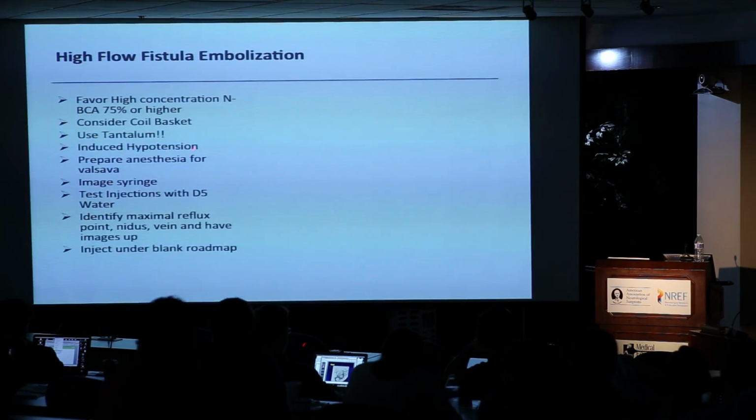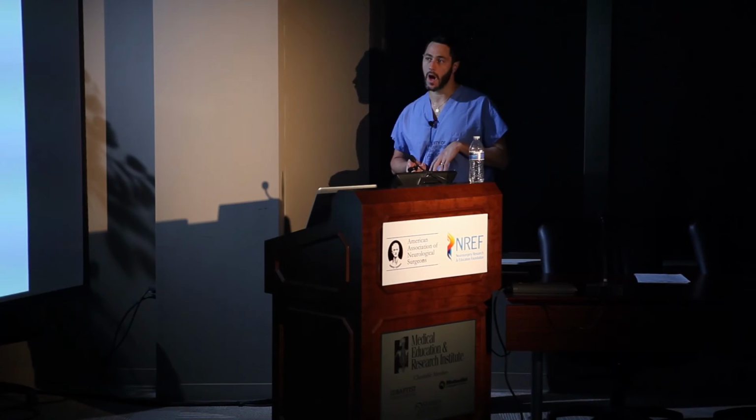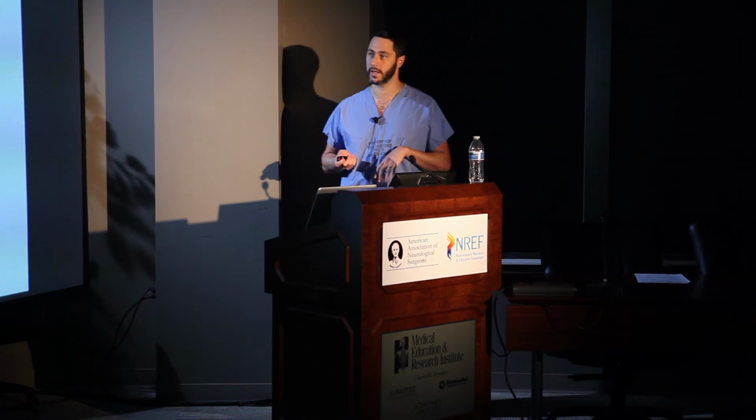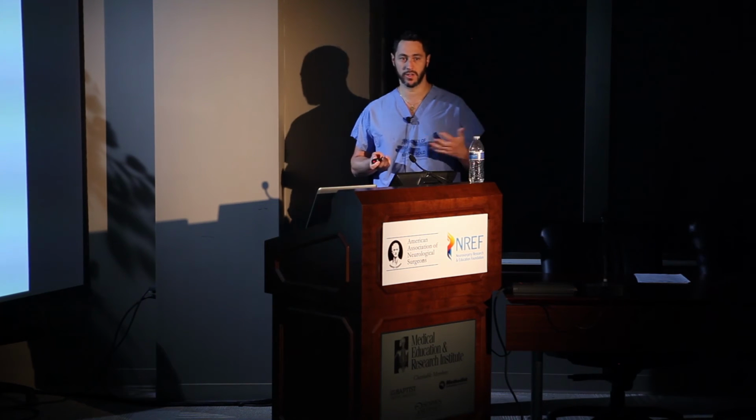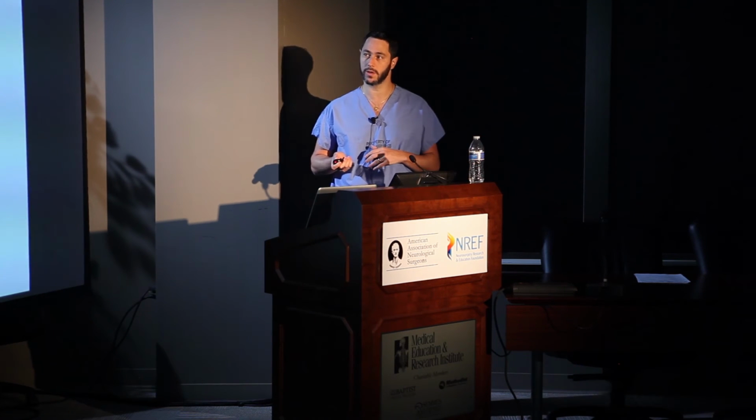I use tantalum almost every single time. I will sometimes ask the anesthesiologist for hypotension and have them prepare to give Valsalva just in case you shoot glue out where you don't want it. And I'll show you an example of that.